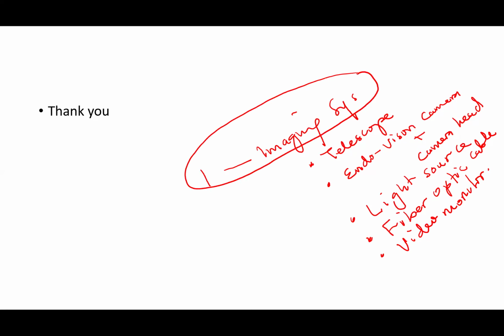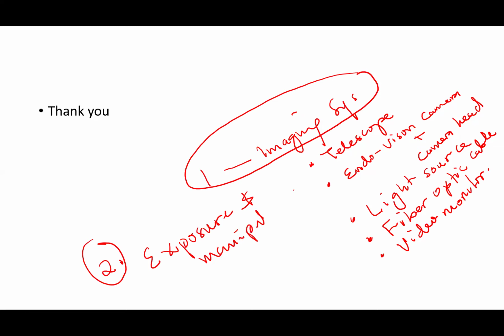So this is the first group of equipment. The second group of equipment, we say, is the exposure and manipulating equipment.